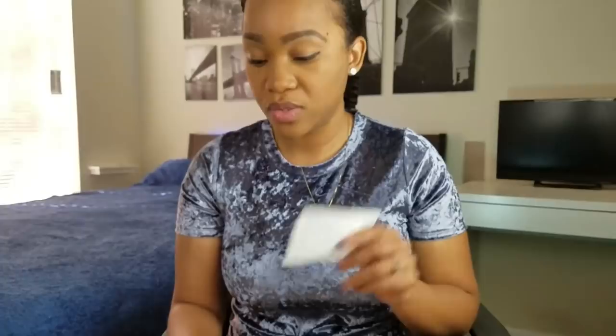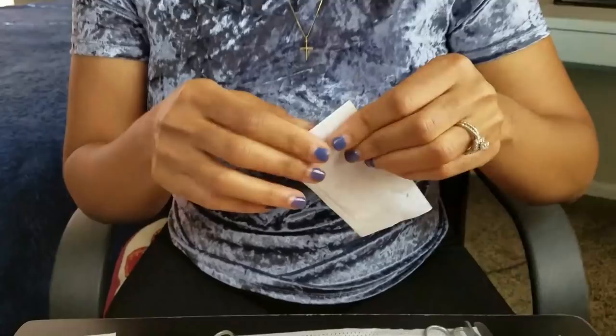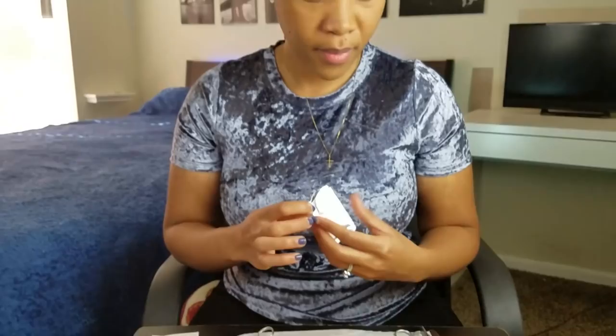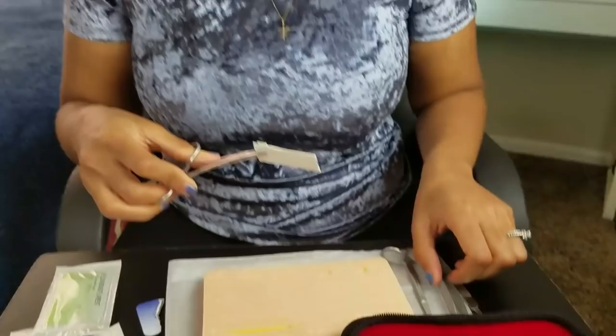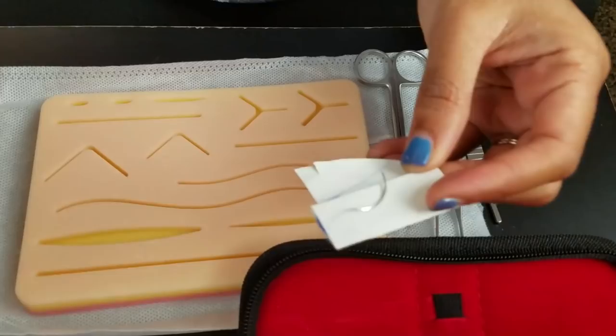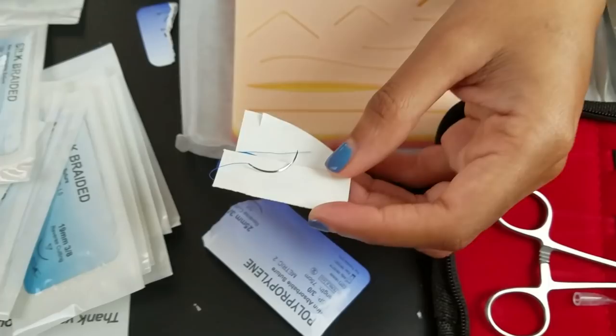So I'm going to use this polypropylene — this is a 3-0. Actually, this is a really huge needle. I don't think I want to use that one. The larger the number, like 5-0, the smaller the thread and the needle. So let's do a 4-0 and I think I want the proline if they have one. Yeah, let's do a 4-0. When I was doing my suturing in the trauma, depending on if it was on the face or something like that, I've used 5-0 and 6-0 needles. They were a lot smaller and the thread itself was smaller as well.